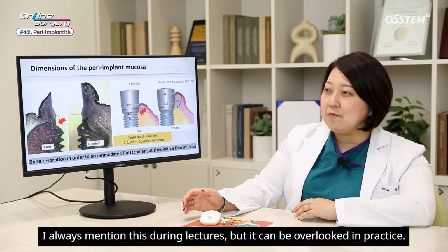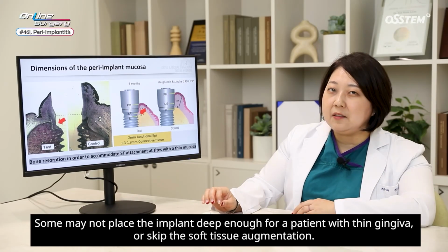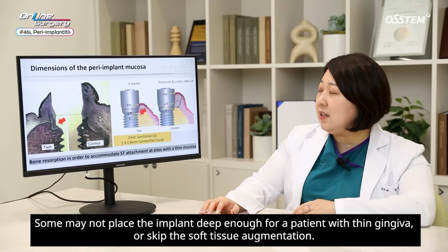I always mention this during lectures, but it can be overlooked in practice. Some may not place the implant deep enough for a patient with thin gingiva or skip the soft tissue augmentation.